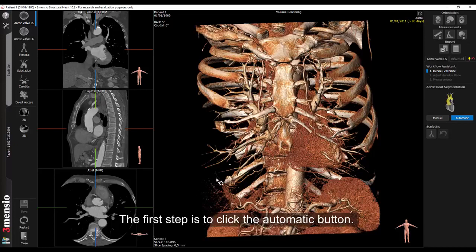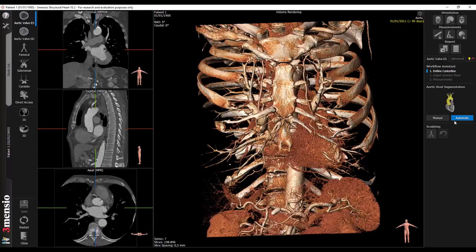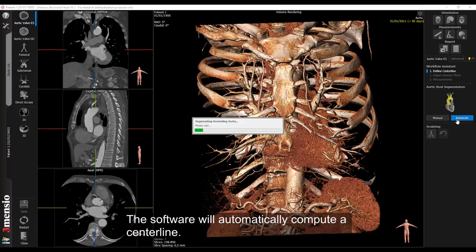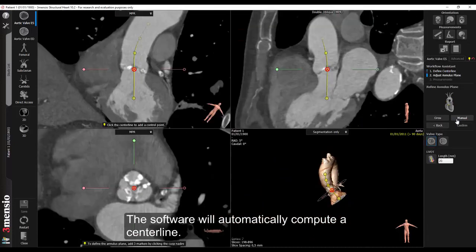The first step is to click the automatic button. The software will automatically compute a centerline.